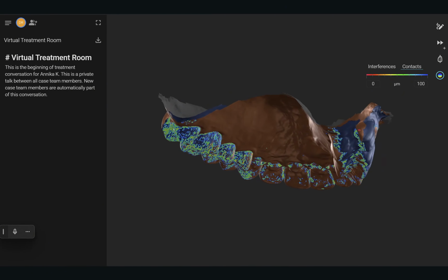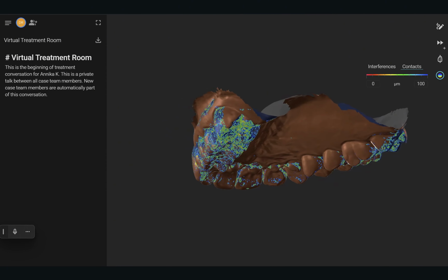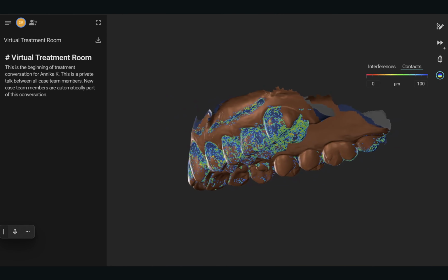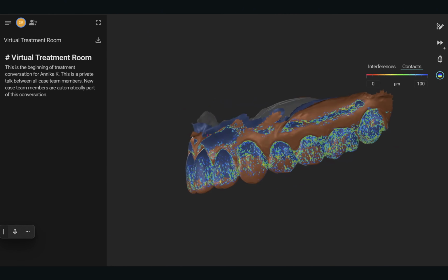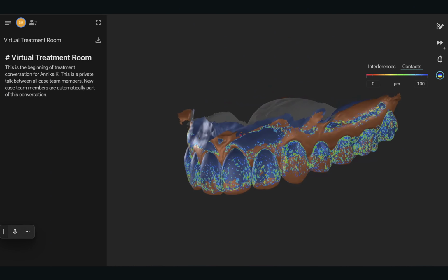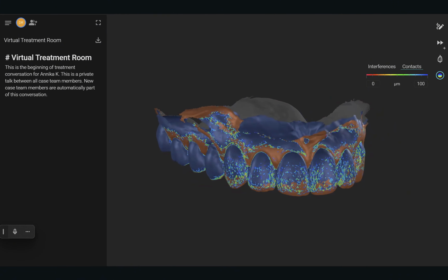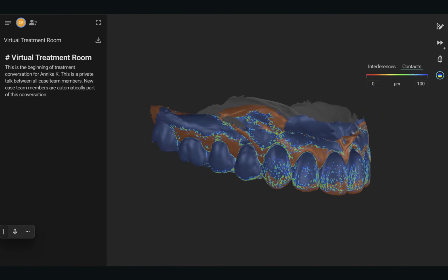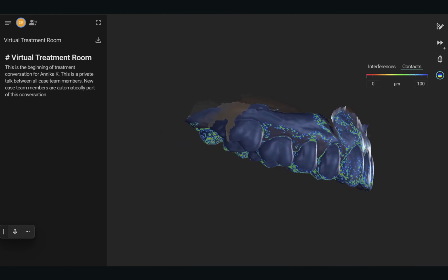This is a primary example of something that you can quickly use to enhance your communication. This is a patient, and I'm sure it's a classic case for a lot of people who've had clear aligner treatment, and she was adamant that the wire wasn't working, it was flexing, that her front teeth were moving.